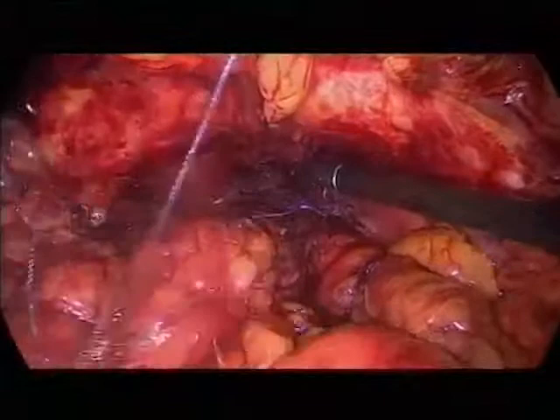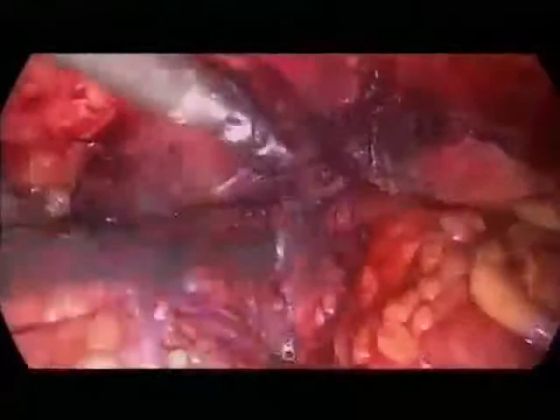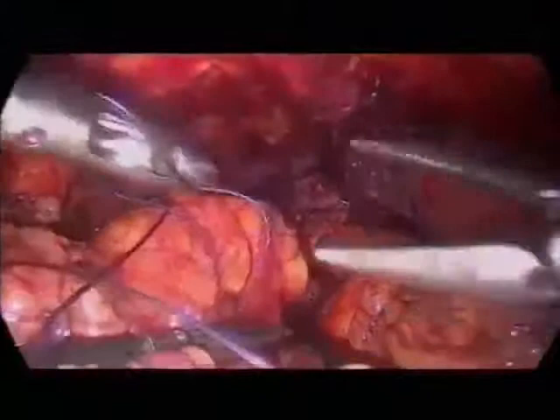Jens-Uwe, show us your last stitches. Second last. It's 11 o'clock. Okay. I hold this suture. So the suture is fixed in my needle holder. Here you see, I have to go out.